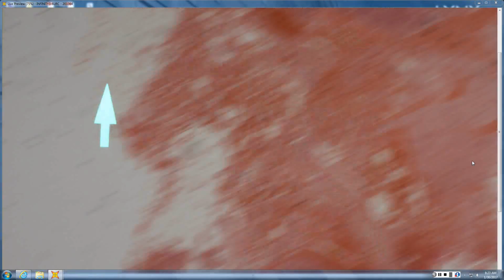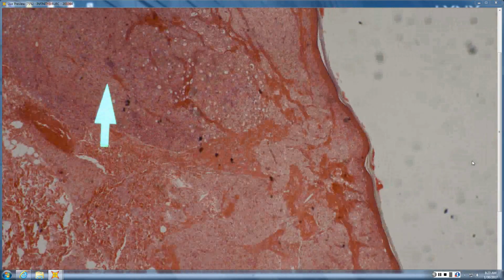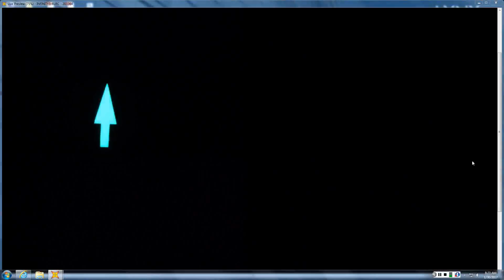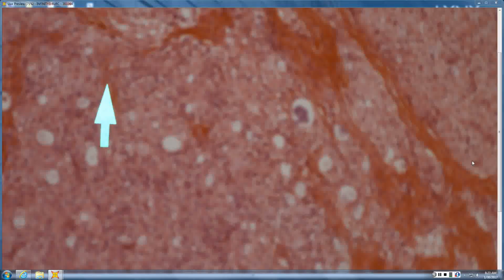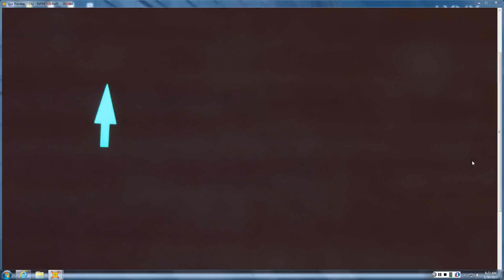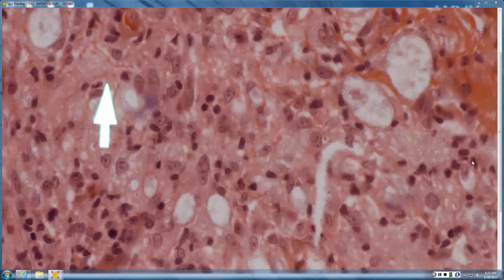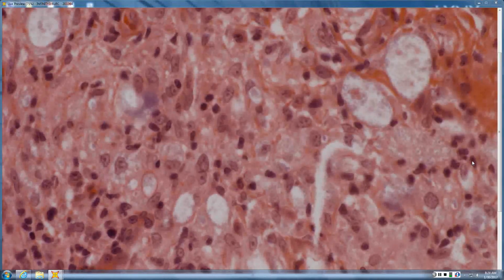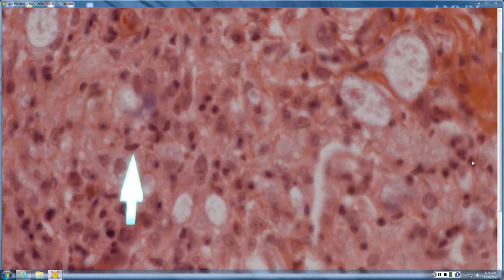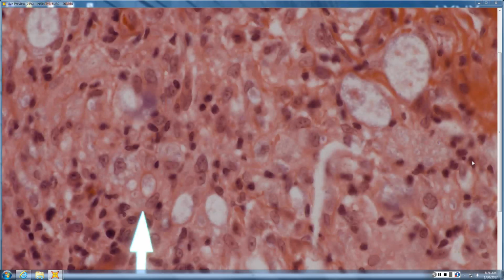Okay. Super atrophic epidermis, and you've got these huge well-formed granulomas that look like globi. So, not really so much, it's more just a histiocytic infiltrate, not a lot of giant cells, and you've got huge globi. So what are you thinking? Lepromatous leprosy. Lepromatous leprosy, absolutely.